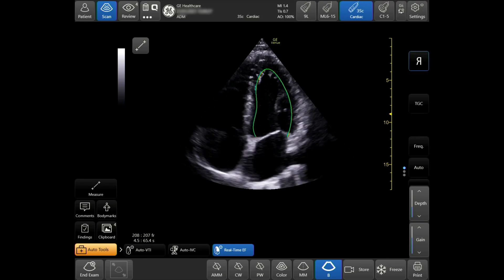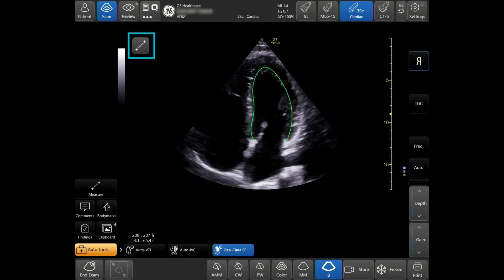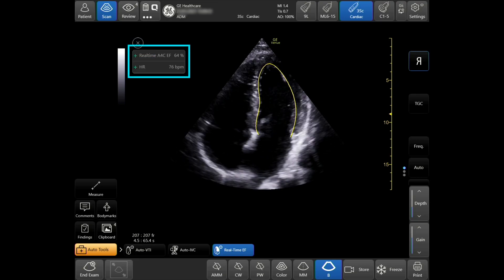If measurements are not displayed, tap the measurement icon to see the calculations.